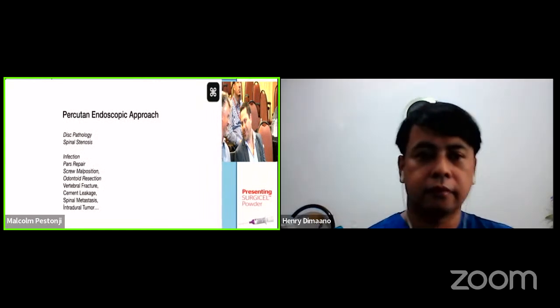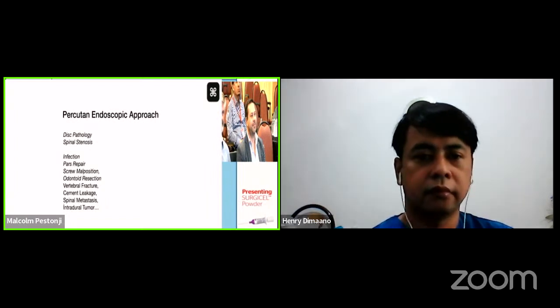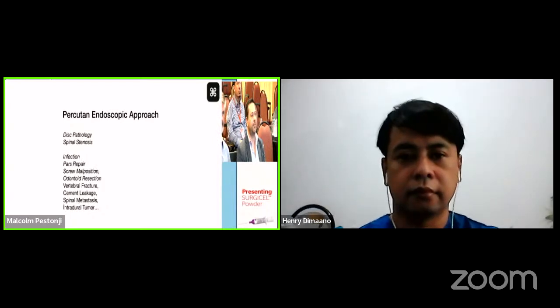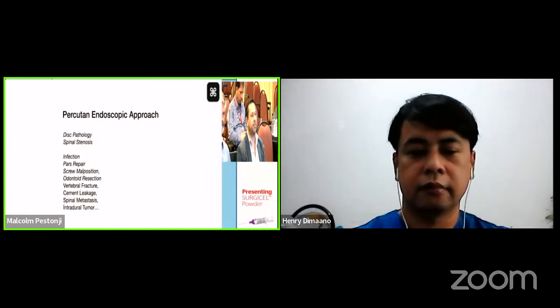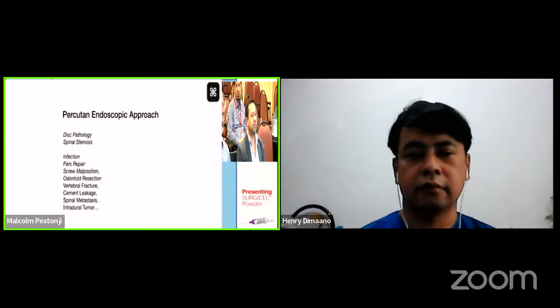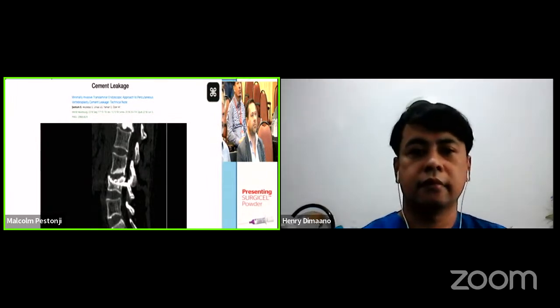What kind of pathologies may we choose endoscopically? We may choose all types of disc pathologies and spinal stenosis endoscopically. There are other indications for which we may choose these endoscopic approaches, and this list will increase day by day. Today we choose infection, fractures, malpositions, odontoid pathologies, vertebral fractures, spinal metastasis, and intradural tumors. These days we may choose all these pathologies, and this list will increase in the future. I believe that. I will share my experience about these advanced cases.